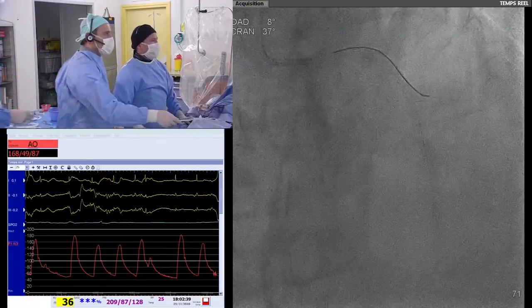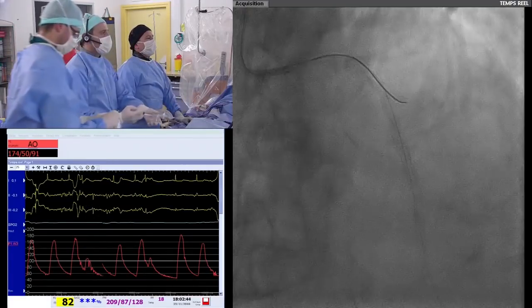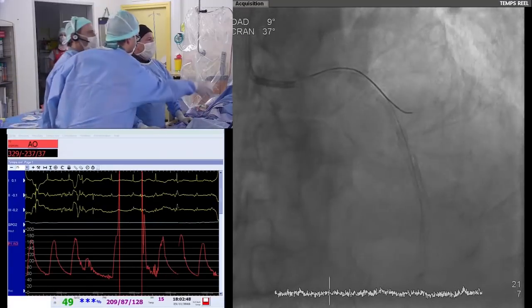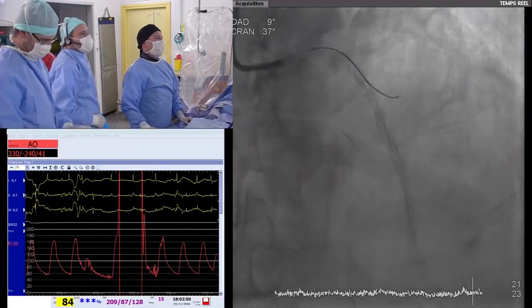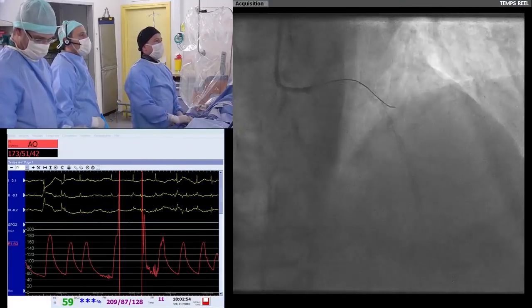We can record this if you want to assess the length. Yeah, go. I don't think we need. Yeah. So I think we have to use a 48. Yeah. Length. From where to where do you want to send, Nicola?